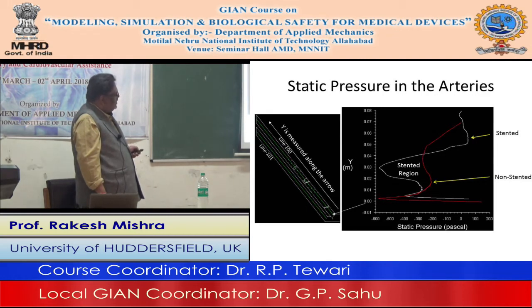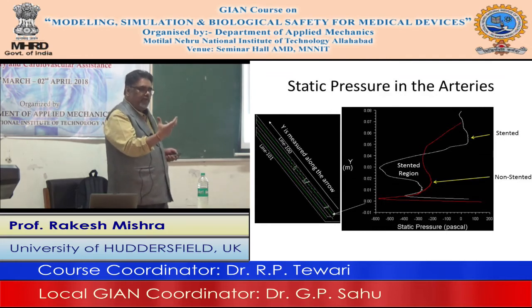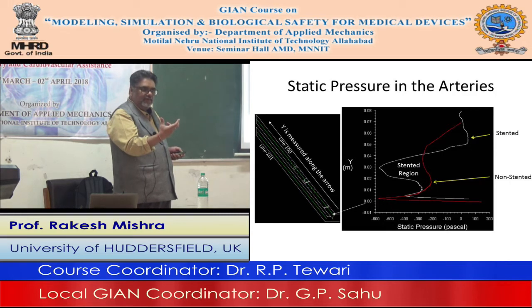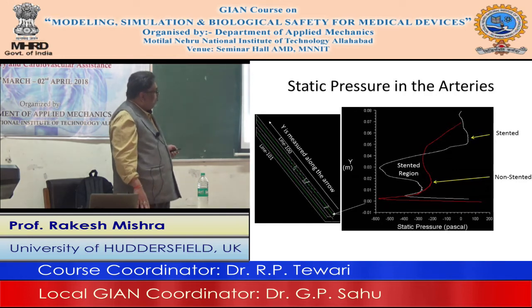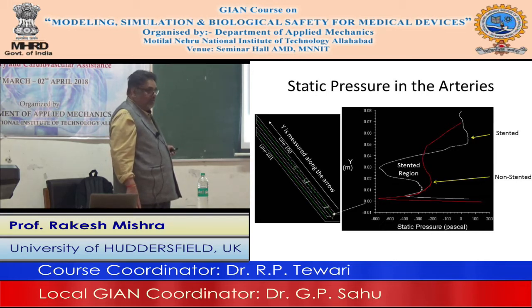Especially in the stented region, pressure has gone very negative. Whereas in the non-stented part, pressure is reasonably constant. You can see here, pressure is changing a bit, but is reasonably constant. But here, the change is very big. So one thing you can immediately see, the stent is being exposed to very heavy pressure changes, isn't it, as compared to the unstented artery. Now, one step further, you can remove the stent from the artery and then plot onto it the flow when there was no stent. In this case, this is one artery against the other artery, but you can run the simulation when there is no stent, and you can plot that figure here and see what is the effect of stent on the pressure field.